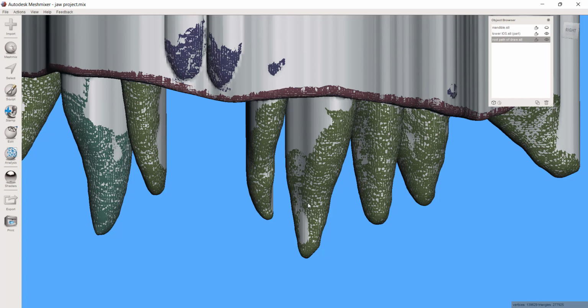You've got the teeth in white and the gingiva in pink. If you have no offset spacer between those, the two parts are not going to seat together, because as accurate as printing is, there's a 50 to 100 micron discrepancy, and unless you create a little slop space, think of it like cement spacer in your crown, those two parts are not going to fit together properly.